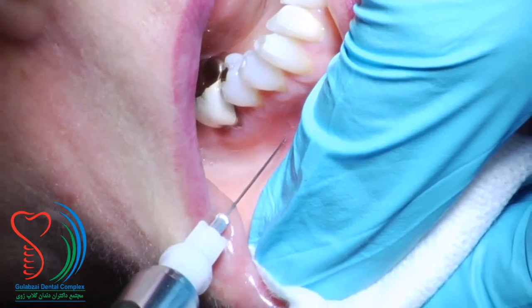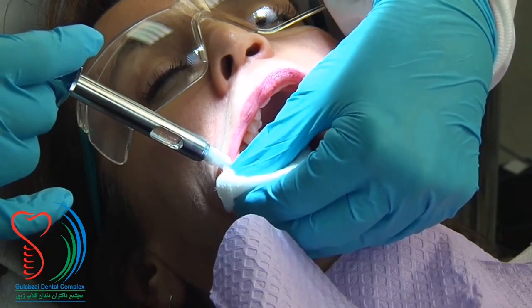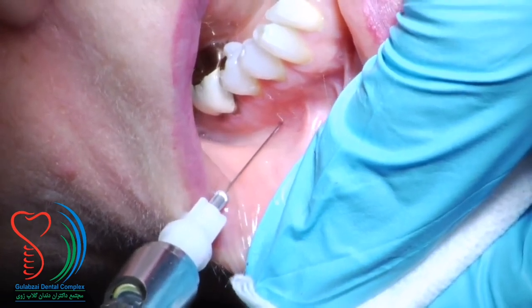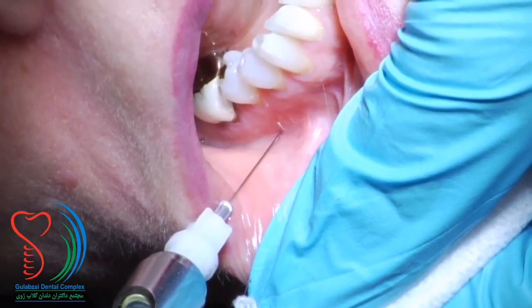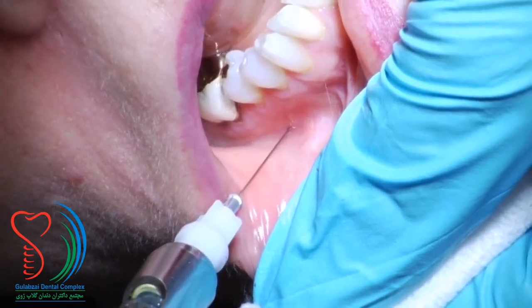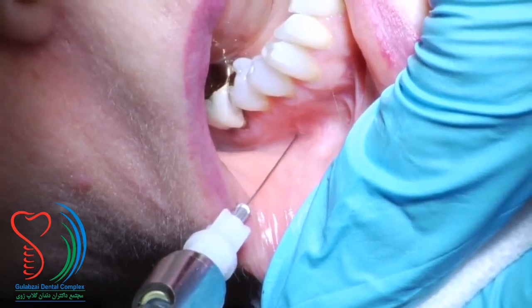After locating the insertion point, align the syringe vertically with the patient's cheek to approach the penetration site, advancing the needle with a slight distal to mesial angle to accommodate the slope of the foramen. The depth of penetration is about 1/4 of an inch. After a negative aspiration, deposit about 1/4 to 1/3 of a cartridge slowly with multiple aspirations.